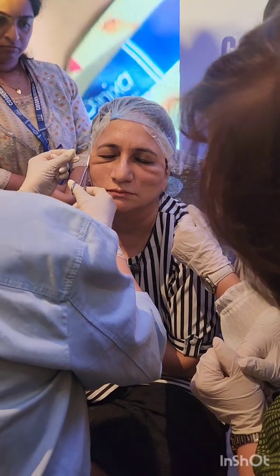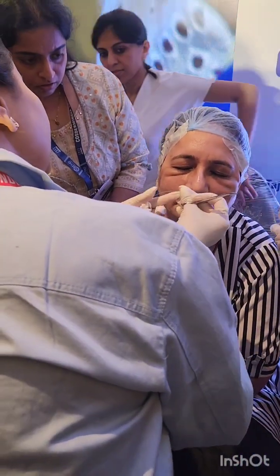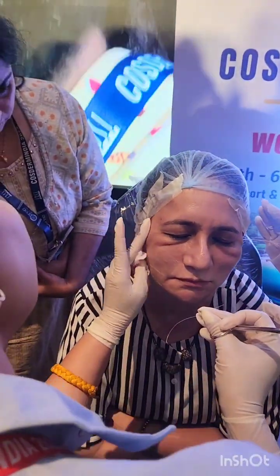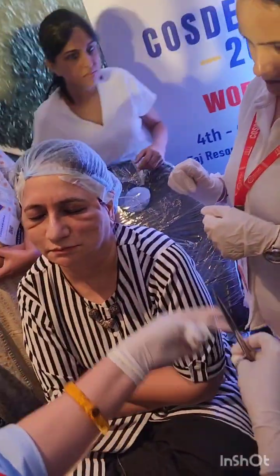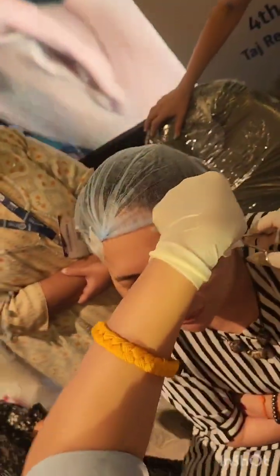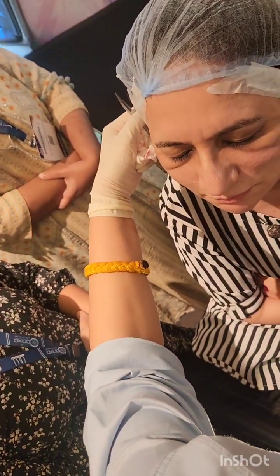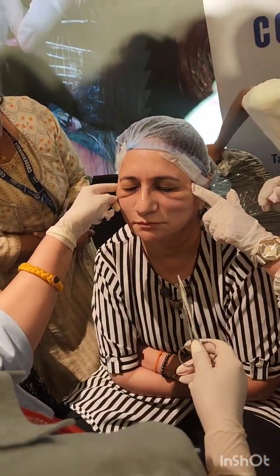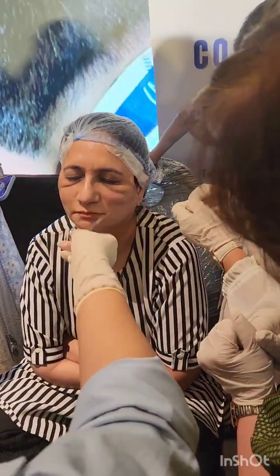I relaxed a little. So push back the thread, but I personally feel that it's a waste of threads here. You can insert the threads. Just check the thread is not palpable. Okay, you cannot touch it. So just push back the skin and cut it. And feel there is no thread palpable, means it has gone inside nicely. Okay, this has lifted very nicely.